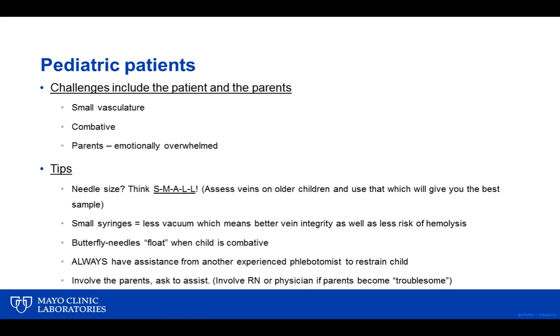As it says here, always have assistance, preferably from another experienced phlebotomist to help you restrain the child. I know that isn't always possible. Oftentimes we just simply don't have another tech available, but you should always hope that you can plan that collection with the assistance of another phlebotomist.